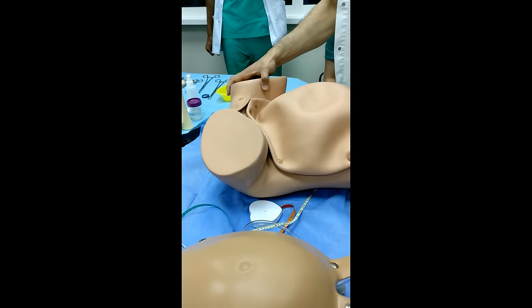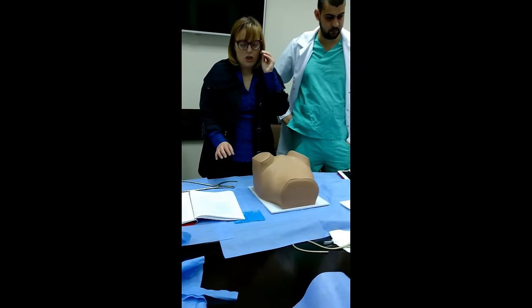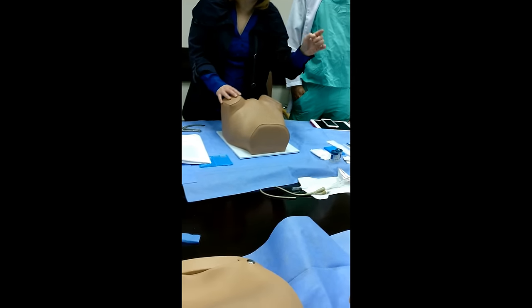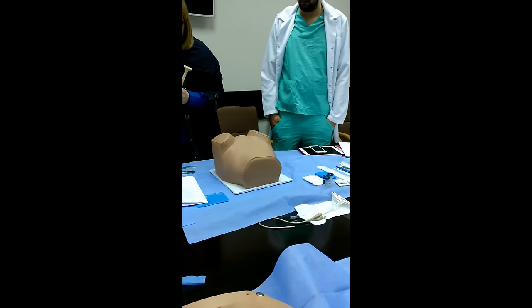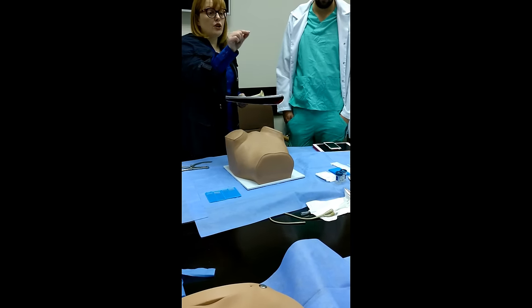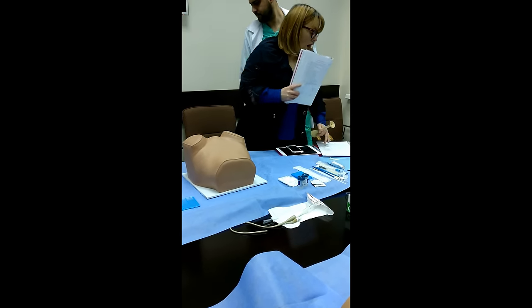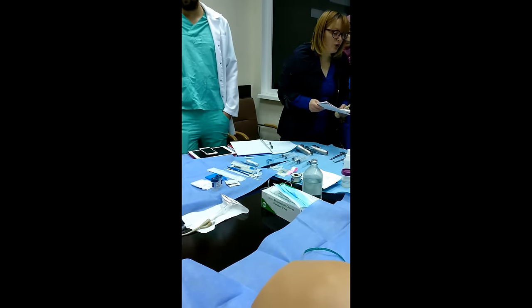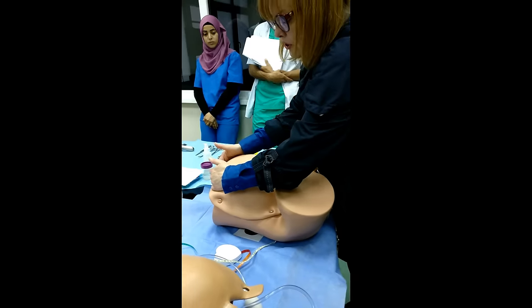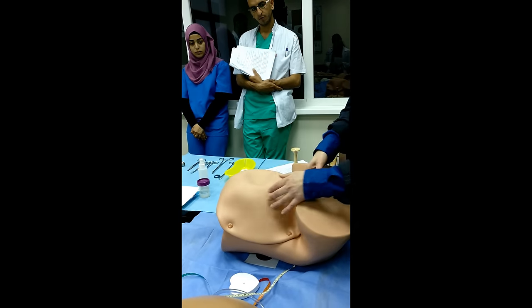So, explain to the patient all the results, okay? Fetal heart rate auscultation. To auscultate fetal heart rate, we use a stethoscope. This is the Pinard stethoscope or a Doppler ultrasound. It's mandatory to perform Leopold palpation. So you perform Leopold palpation, the steps, and you determine the position.